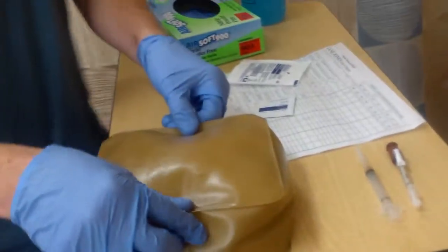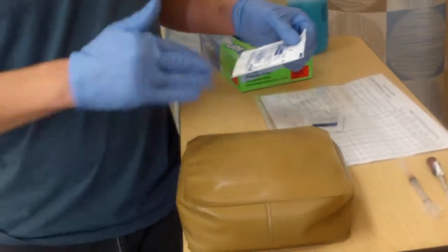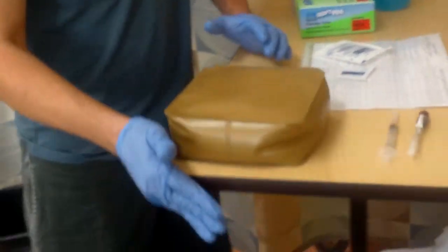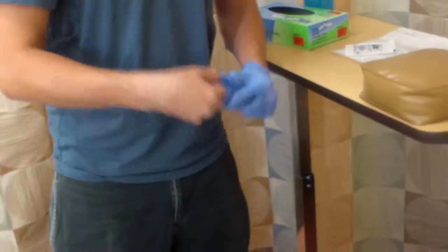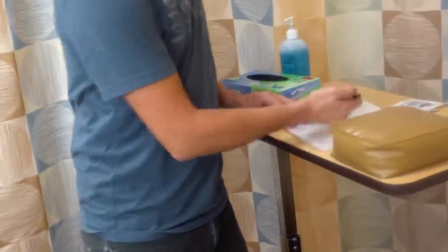Okay, and then this goes immediately in my sharps container. Let's do a little quick cap on that because I need that. So then after that, if there's any other kind of medication, I would just apply very light pressure and just kind of make sure there's all the medication's done. So then after that, move my table a little out of the way here. So then I would dispose my gloves. I would immediately chart on my MAR that I've administered this medication.